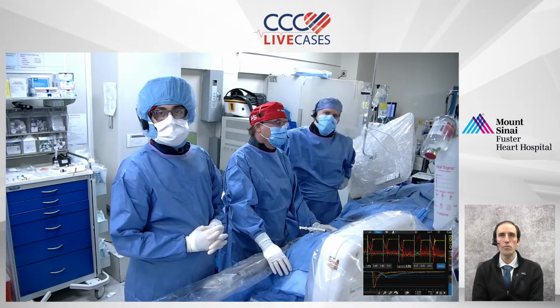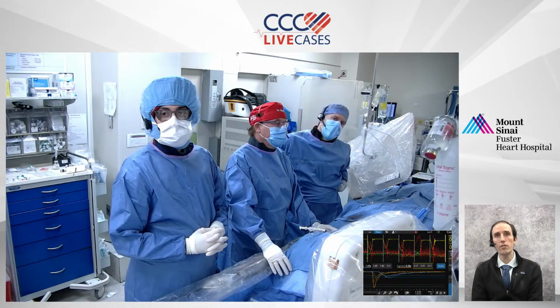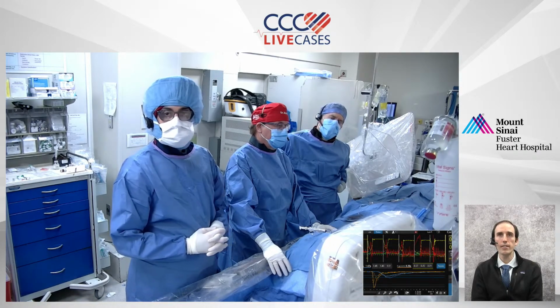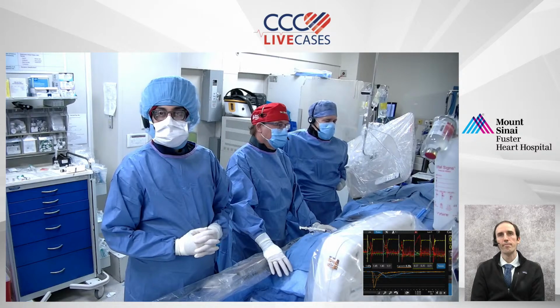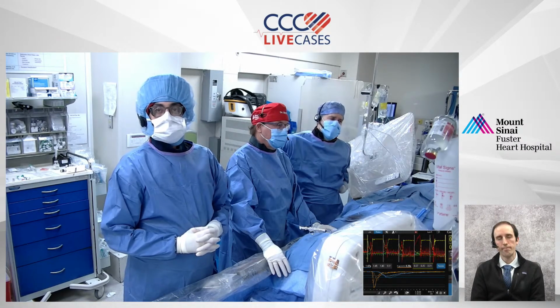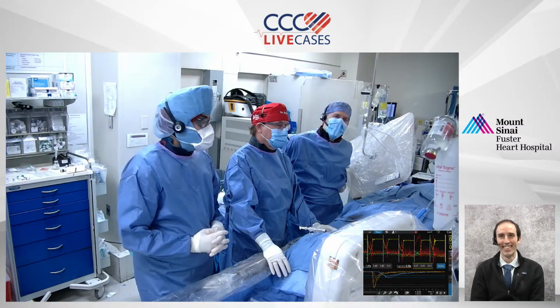I've not done that, but it is something you could consider in somebody who's very bradycardic at baseline who has an indication for testing. Sometimes we put pacer pads on just in case, and the perfect patient is a patient with a pacemaker actually.